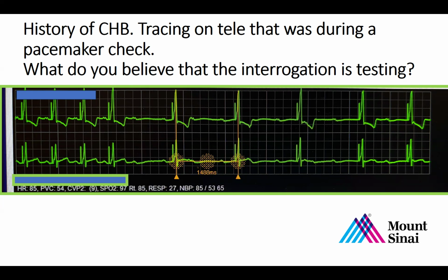So that's just the fact. And so sometimes that makes us a little nervous because we don't actually know what the R wave is. But we assume that if the pacing impedance is normal, if the pacing threshold is normal, that probably the R wave is large enough that it would be sensed in the event of an intrinsic ventricular event, and it would not pace at that time.